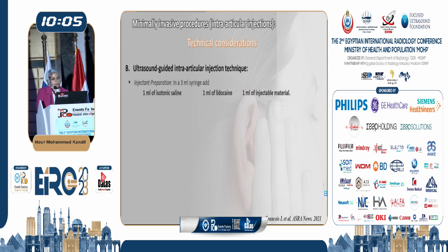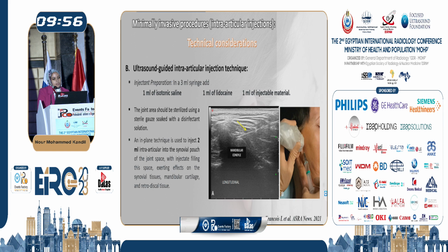The injection could be prepared by mixing 1 ml of isotonic saline, lidocaine, together with the injectable material. Under aseptic conditions, an in-plane technique is used to inject 2 ml intra-articular into the synovial pouch, with the injectate filling the space, exerting effects on the synovial tissues, mandibular cartilage, and retrodiscal tissue.